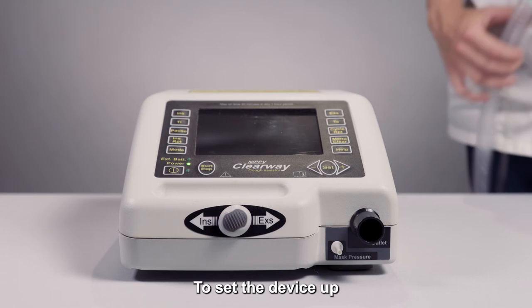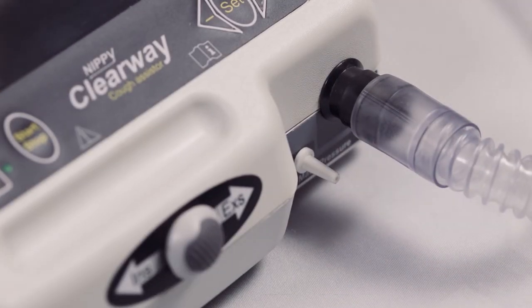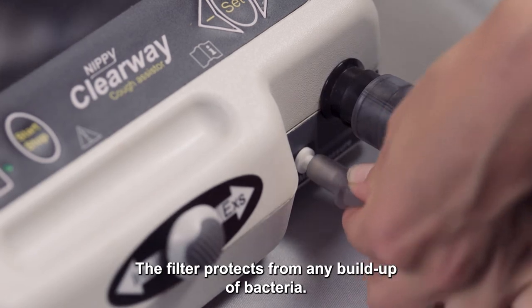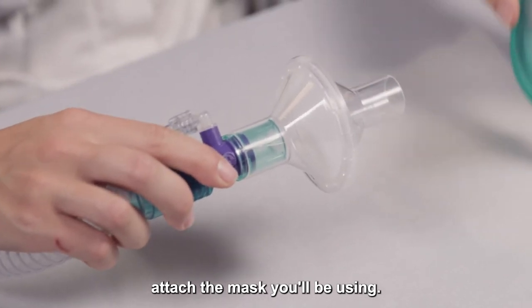To set the device up, connect both ends of the tubing onto the Cough Assist as shown. The filter protects from any build-up of bacteria. At the other end, attach the mask you'll be using.